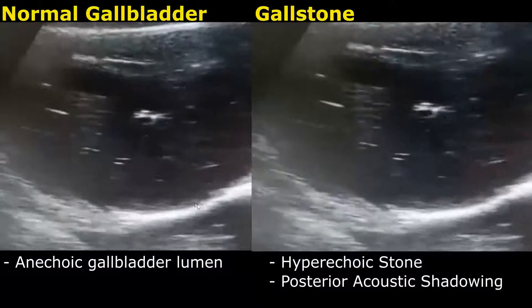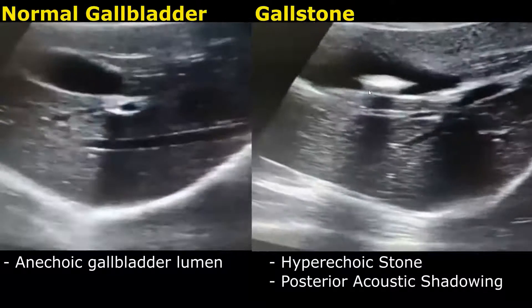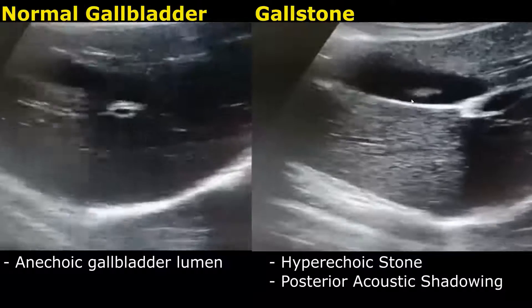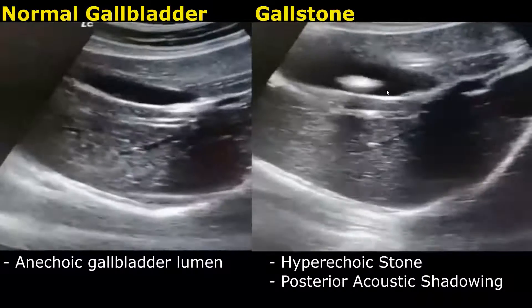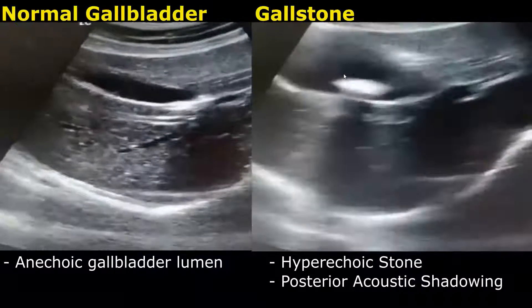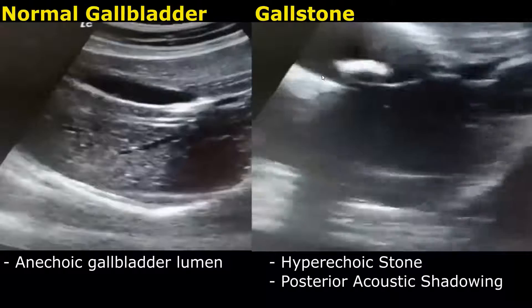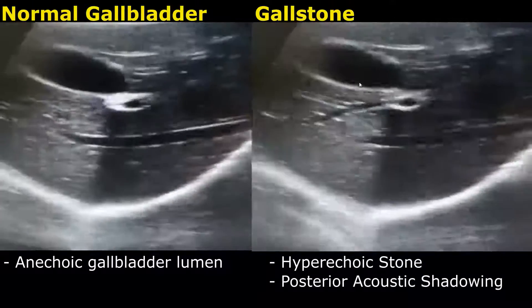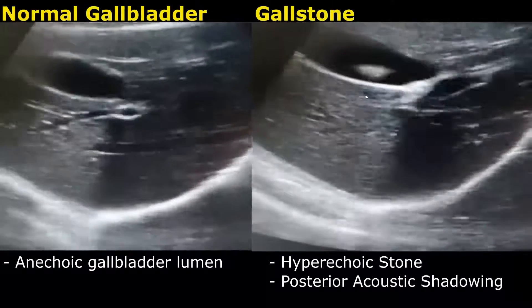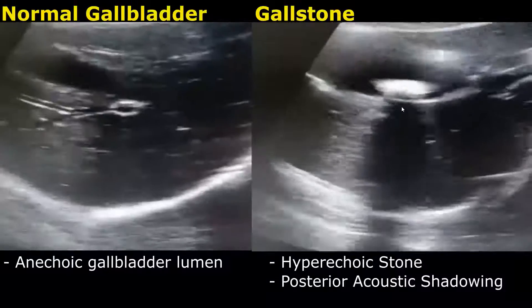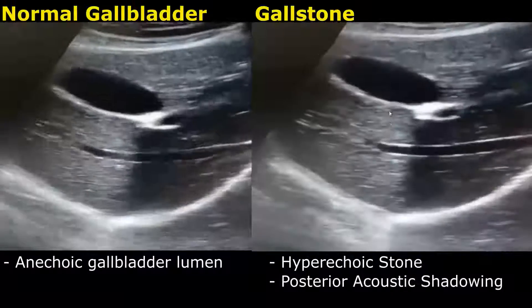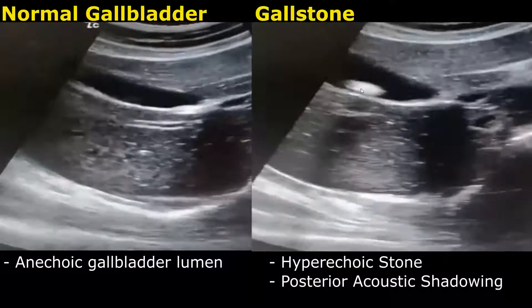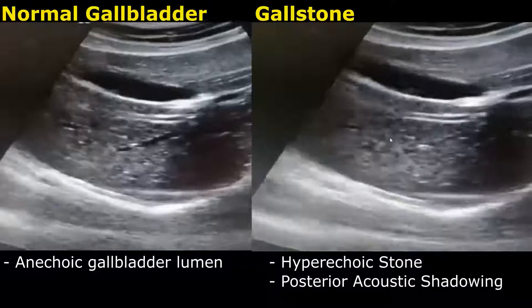In the image on the right, we see a hyperechoic gallstone within the anechoic lumen of the gallbladder. The gallstone is producing posterior acoustic shadowing. We can only see a single gallstone, and it is large enough to produce a large shadow.